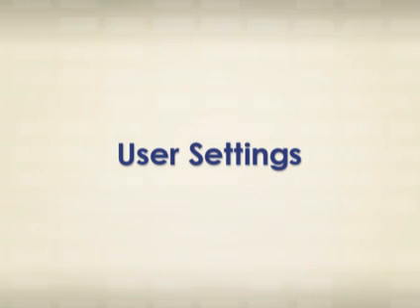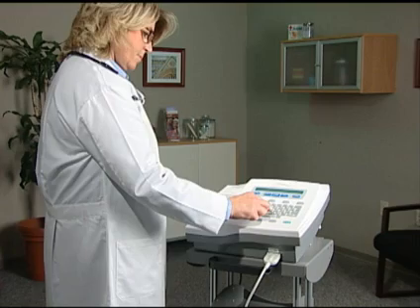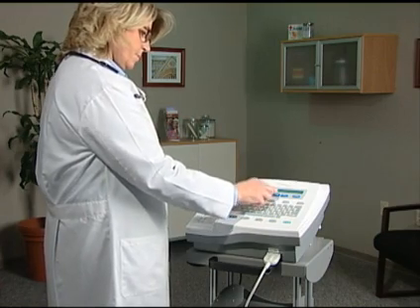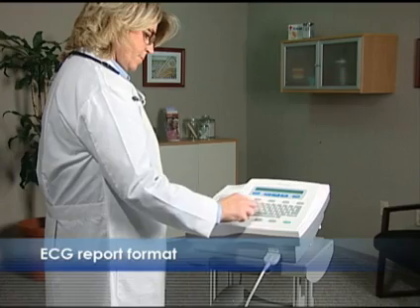The Atria 3100 is shipped with default user settings, which can be used to immediately acquire an ECG. To change these settings, use the Settings menu. Let's go through a settings example. How to change the number of copies the device prints.